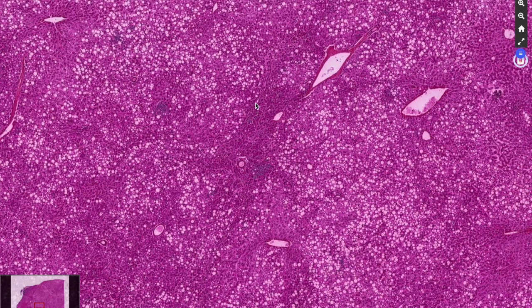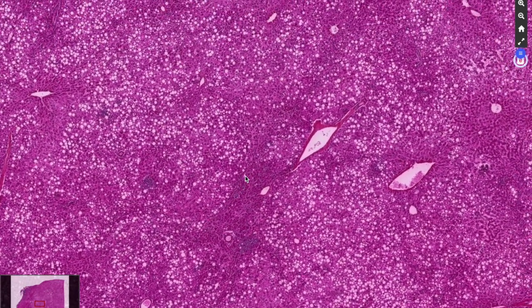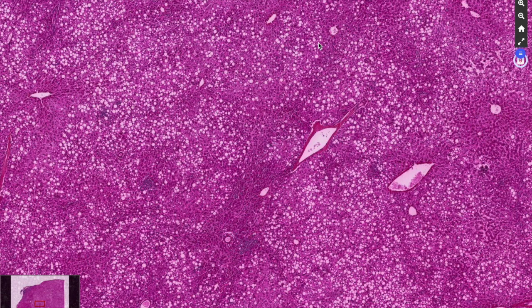There is the beta-catenin mutated adenomas that show a nuclear accumulation of beta-catenin by immunohistochemistry, and also a strong and diffuse expression of glutamine synthetase. And there is the fourth group, the sonic hedgehog adenomas. So far there are no reliable markers. There have been some preliminary markers, ASS1 or PTGDS, but they have to be validated.